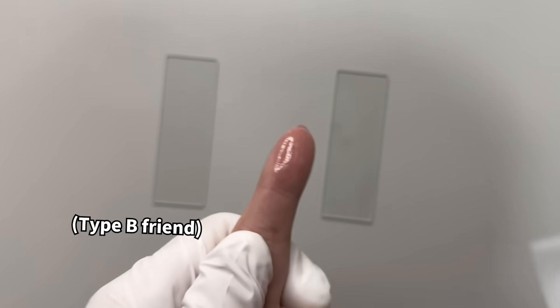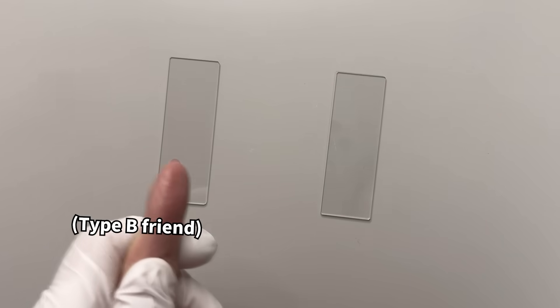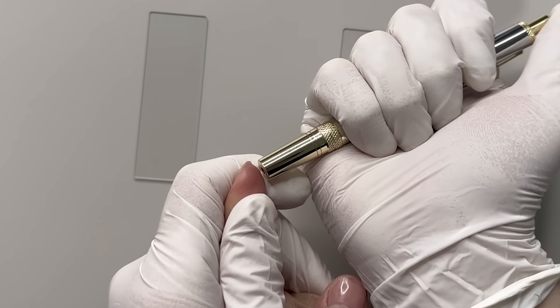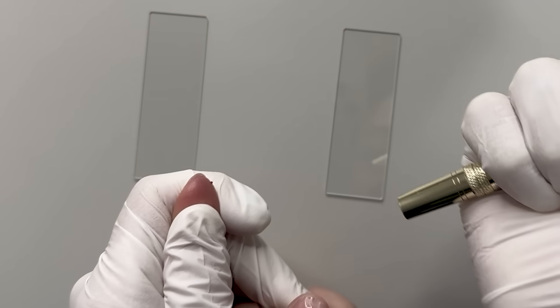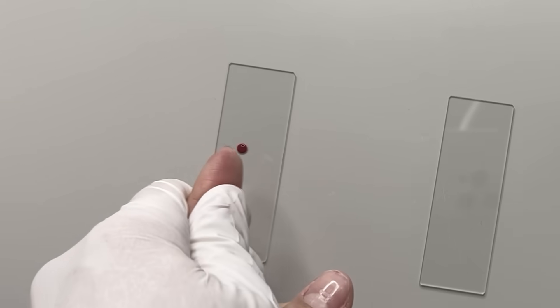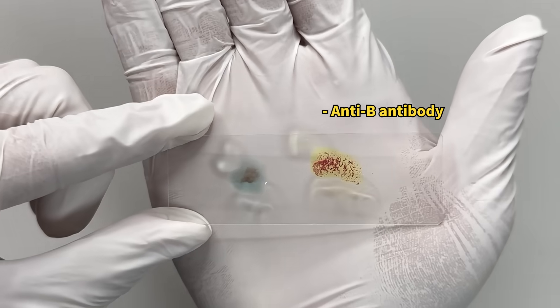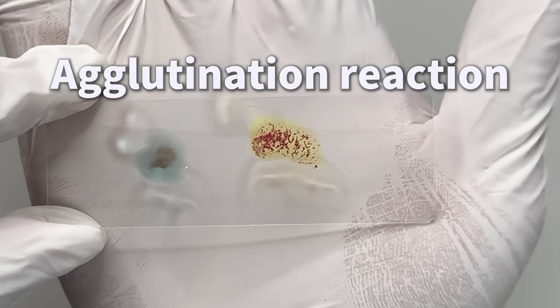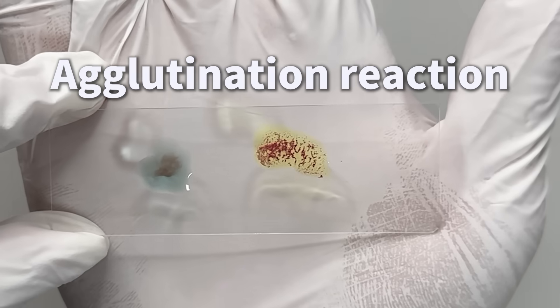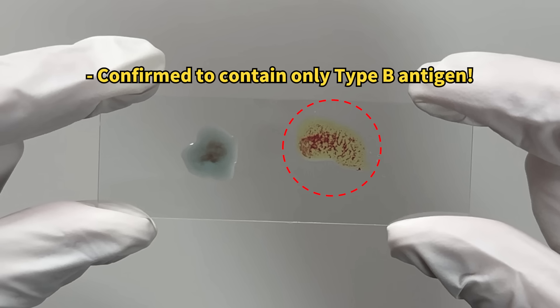Curious about other reactions, I took a sample from a type B friend nearby. After dropping his blood on a slide and adding the reagent, we observed the blood clotting due to the reaction with the antibodies specific to type B. This confirmed that my friend was indeed type B.